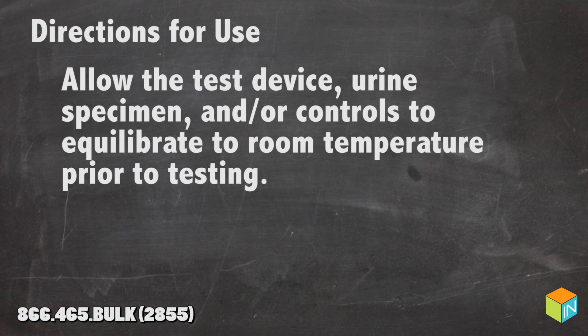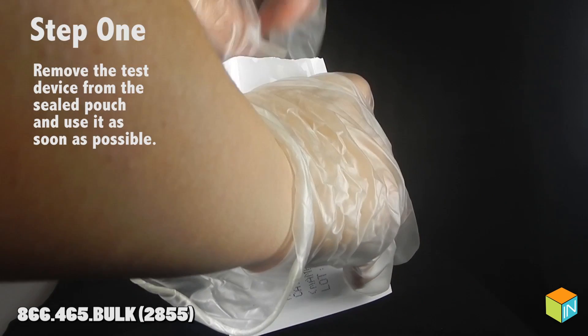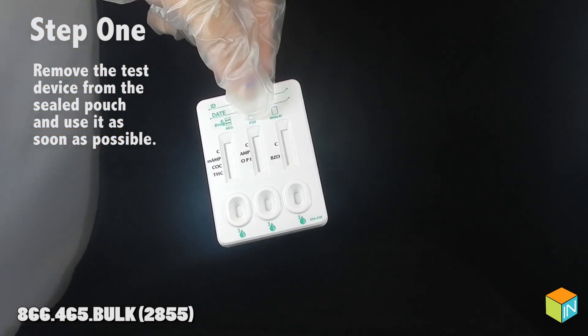Directions for Use: Allow the test device, urine specimen, and controls to equilibrate to room temperature prior to testing. Step 1: Remove the test device from the sealed pouch and use it as soon as possible.